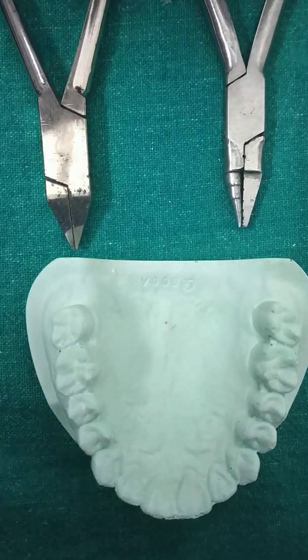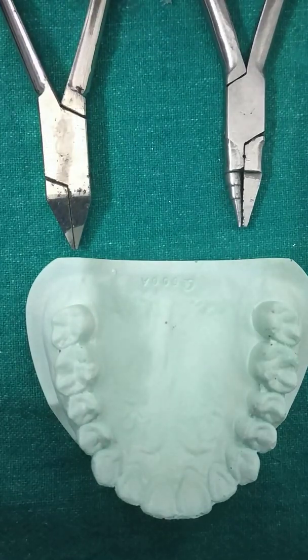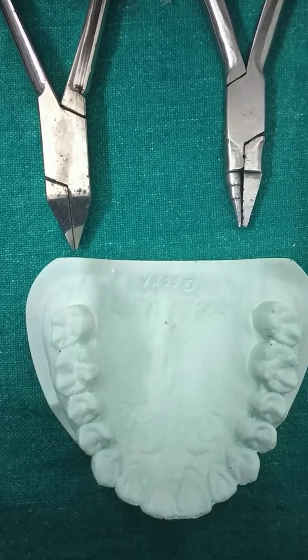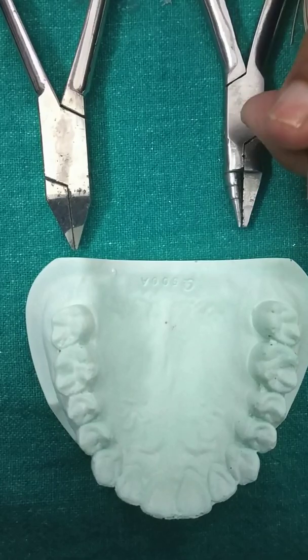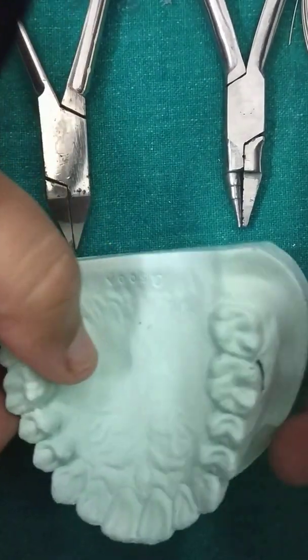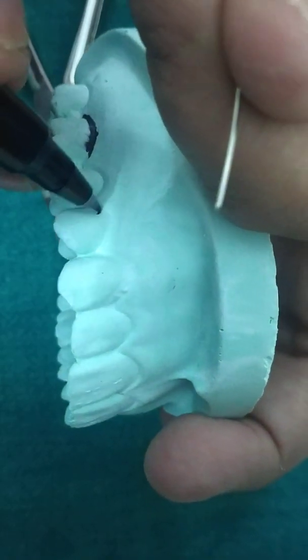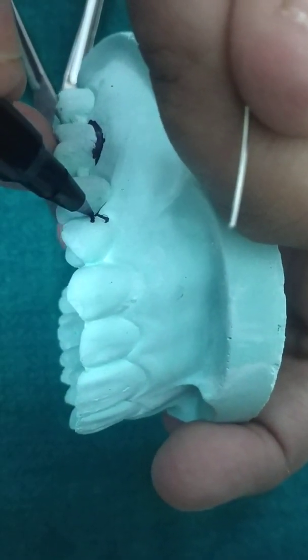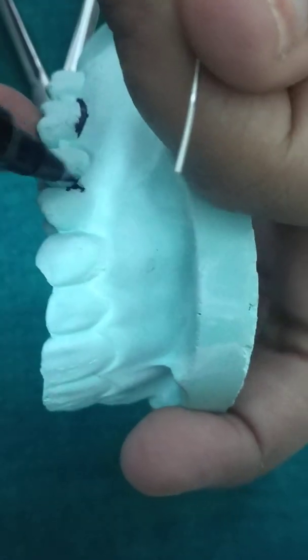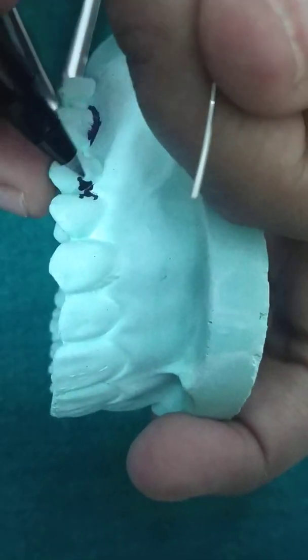We are making a pin head clasp. The basic function of a clasp is retention, and in the pin head clasp, retention is taken from the undercut region in the interdental area. We will be taking retention from between the premolars — specifically below the contact point, in the undercut region between both premolars.